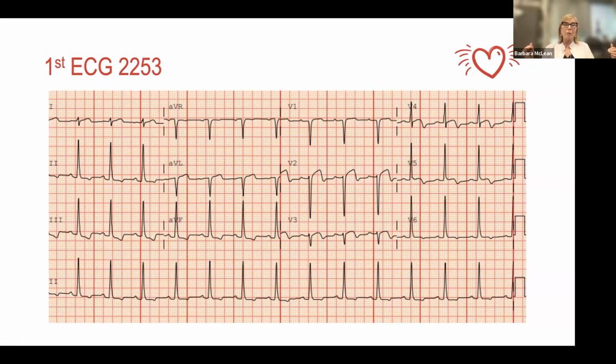I'm pretty good at evaluating EKGs, but for me, I would still refer this to a cardiologist, and I would do it now. No, I'm not really going to wait, because you've got acute chest pain and you've got a strange looking EKG, and I'm not really clear that I can, even if I'm a great ECC attending or a great MICU attending or a great trauma surgeon or anybody who's not a cardiologist, I'm not sure that I have the capacity to actually rule in or rule out anything that's occurring for this patient.